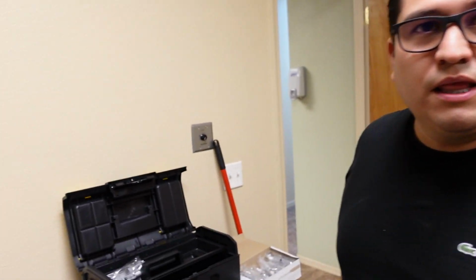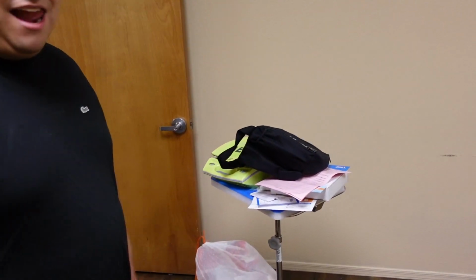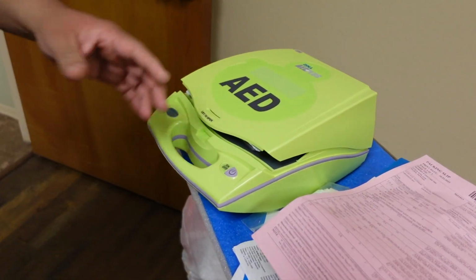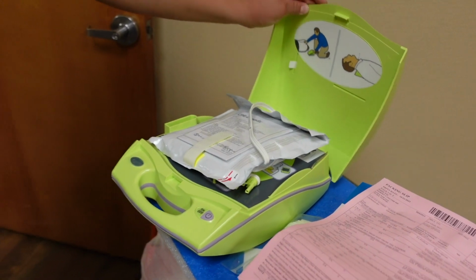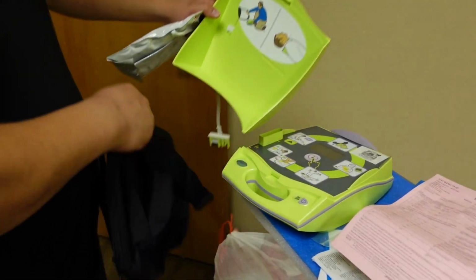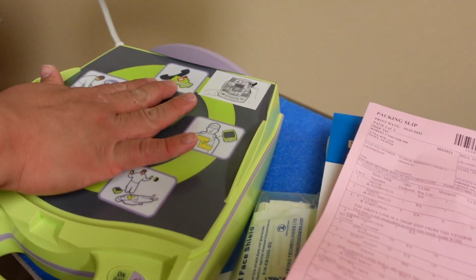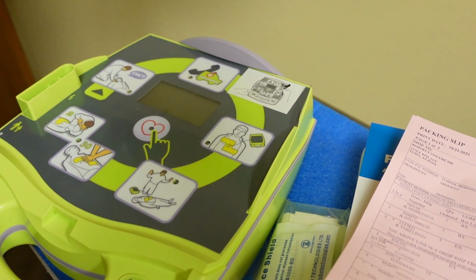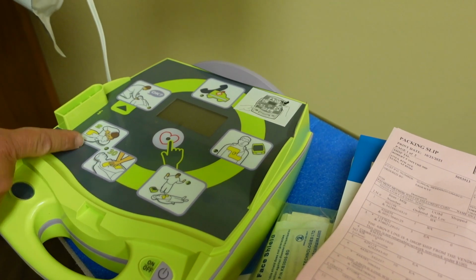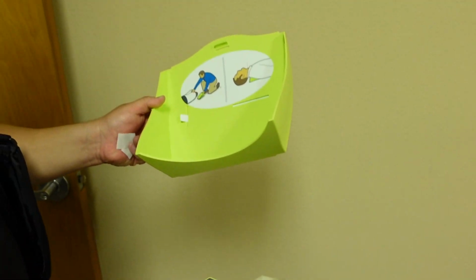So walk us through some of this cool stuff, because I've never even seen that thing. Let's start with that first. This is the AED. This is for when patients are having an arrest. This is brand new, we just unopened it, so it has all the pictures. It tells you what to do. First, position the patient, make sure the patient's okay, call 911, set this up. We'll have the pads, which go like this. It gives you the picture. Then we can do CPR and respirations if needed.